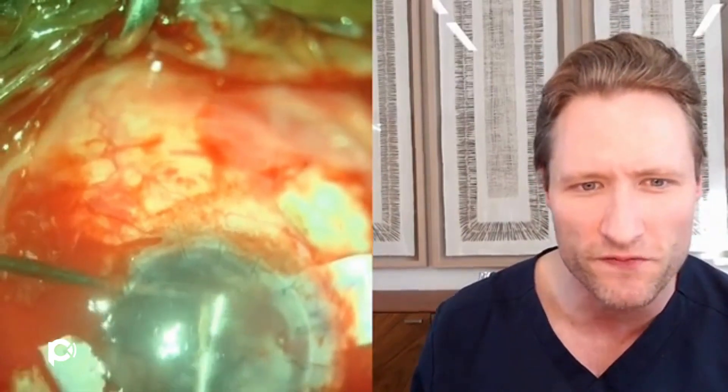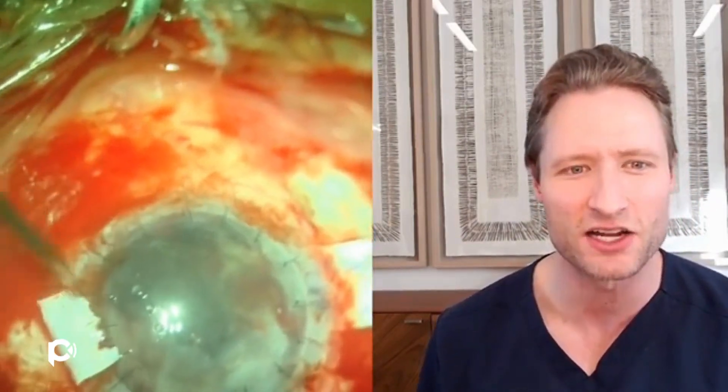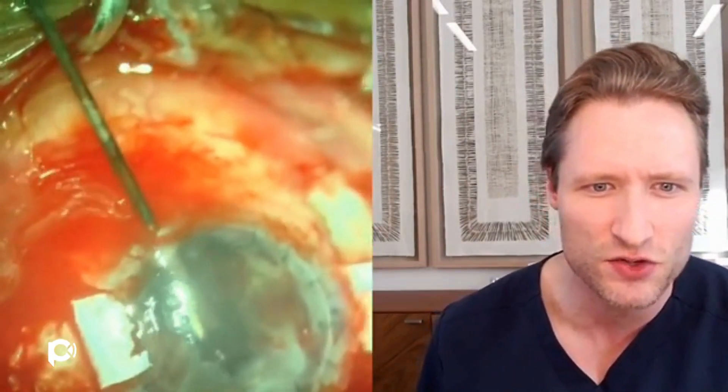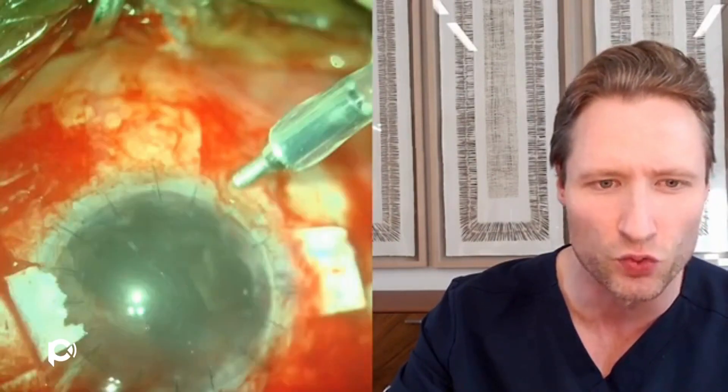Now remember, this is a pseudophakic eye — there's a lens and a capsular bag in here somewhere, and it's not clear where those things are. I really don't want to drop this lens into the back of the eye. So very carefully, I'm looking as I'm doing this to see where the lens is — can I find it, and if so, can I grab it so I don't lose it. Here I am taking more bites and snipping out iris as far back at the root as I can.